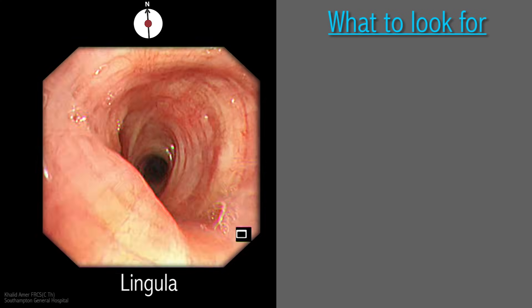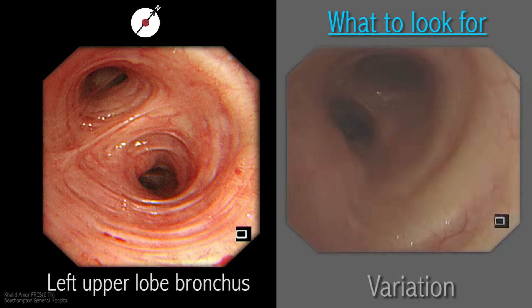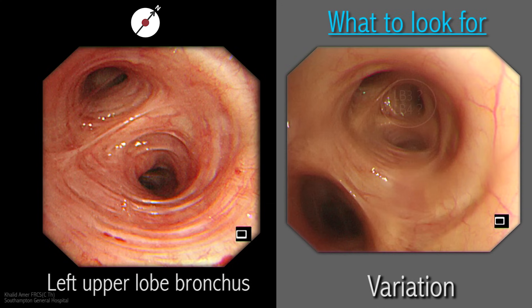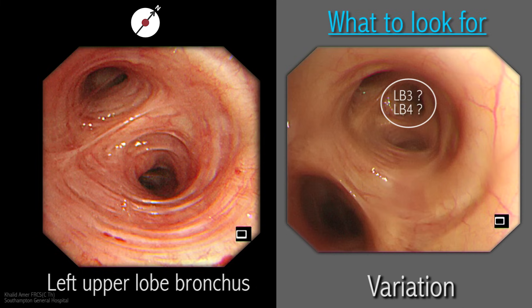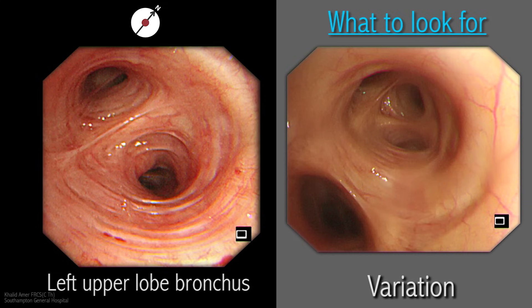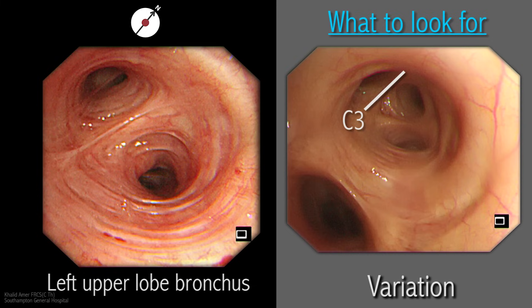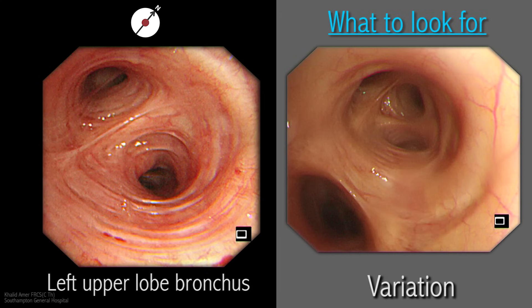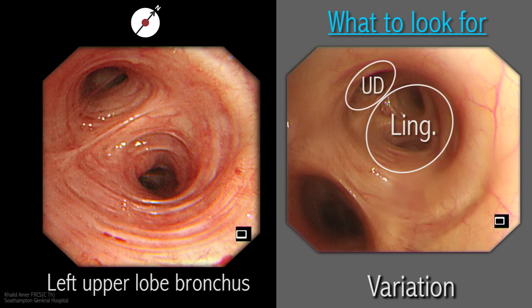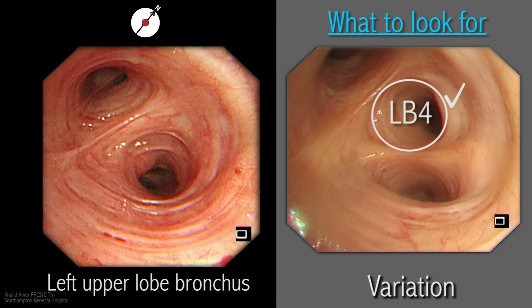Before examining the lower lobe, let us examine some variations of the left upper lobe — this is a good example of how carina recognition plays a crucial part in resolving confusion. The upper lobe is showing three divisions instead of two, and the middle one is confusing: should we call it LB4, the superior segment of the lingula, or LB3, the anterior segment of the upper division? Only when deciding where the tertiary carina is does the anatomy become clearer. C3, which divides the upper division or trisegment from the lingula, is higher and more proximal than the next level in the hierarchy, in this case C4. Subsequently, the upper left orifice has to be the upper division or trisegment, and the middle orifice is part of the lingula — i.e., LB4.